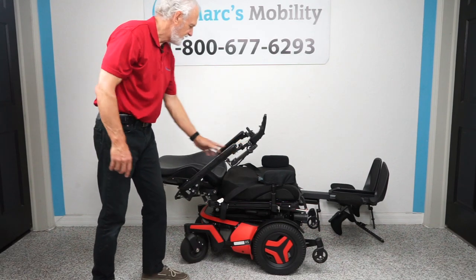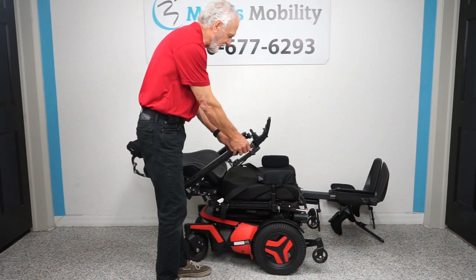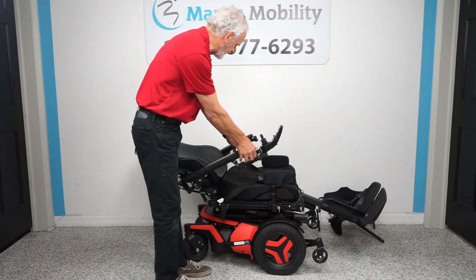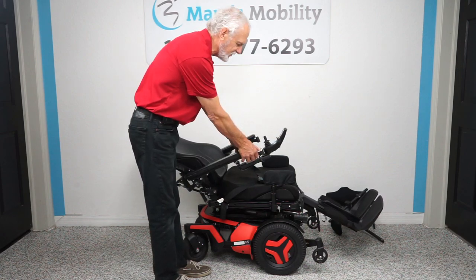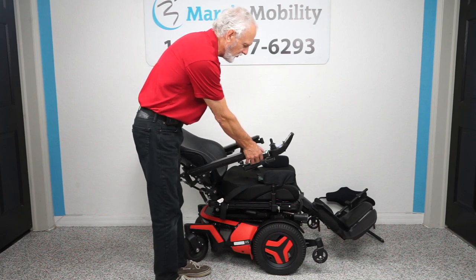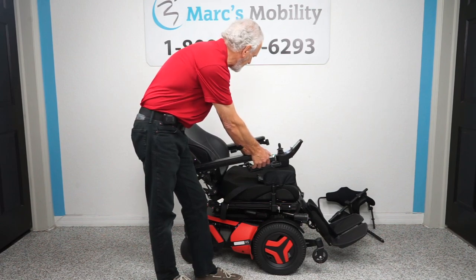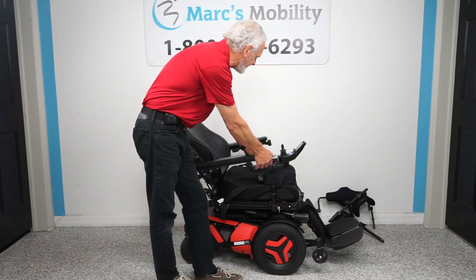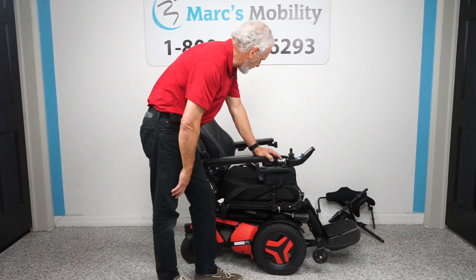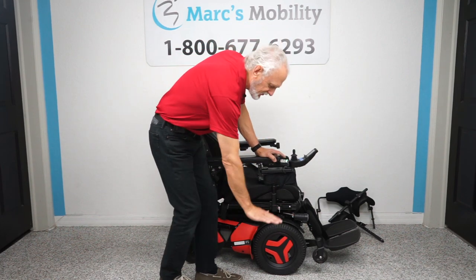The chair goes pretty much completely flat. That's your electric recline — the chair laying completely flat. Now I'm going to bring the electric recline back up and bring the legs back down. I'm doing two buttons at once — you can also do that through the joystick. So we've now covered: the legs going out, the recline, the seat lift, the tilt, the standing position, and the anterior tilt.